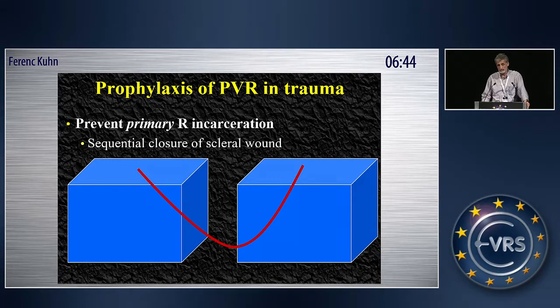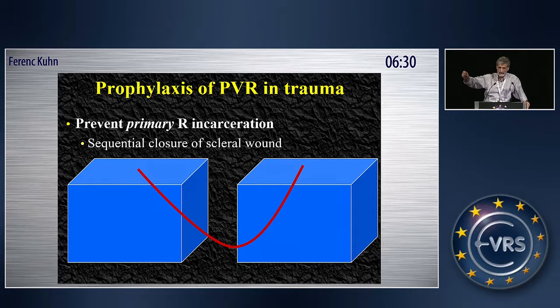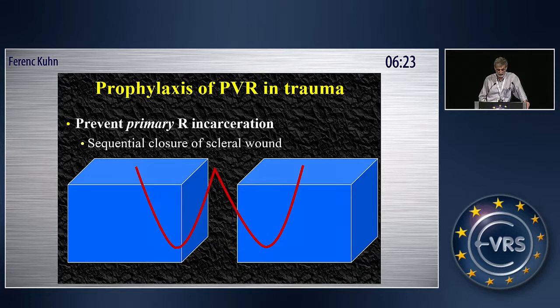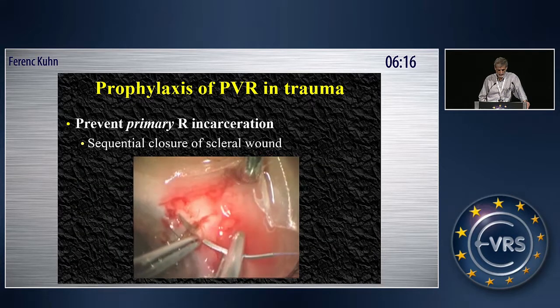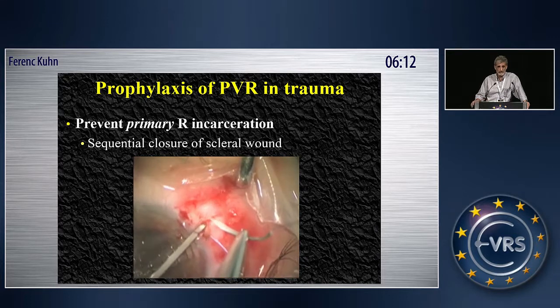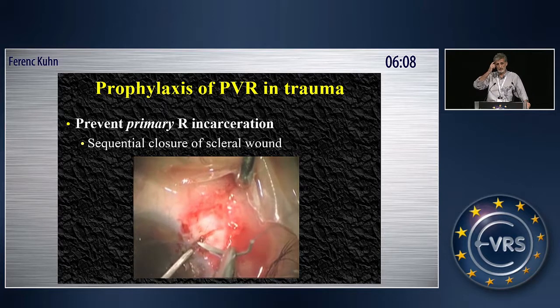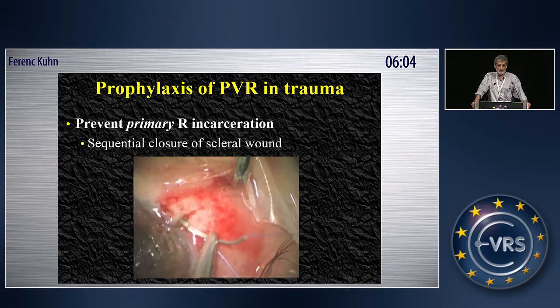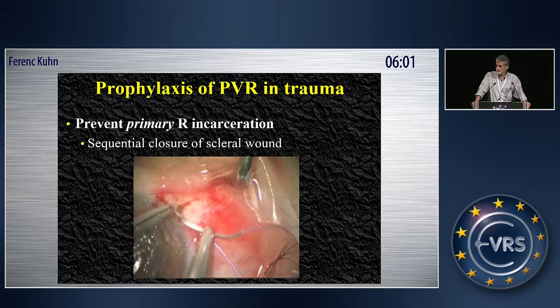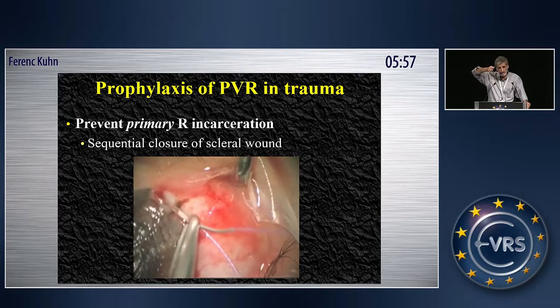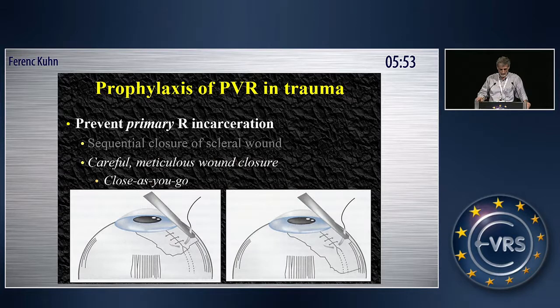Incarceration is a huge issue. This is something you can do to avoid trapping tissue, which will lead to a retinal detachment later. Traditionally when you close a wound you make one pass with the needle — this is a great way to catch retina in the posterior sclera. A very simple solution is to do a sequential suture introduction. You go in on one end, one side of the wound, you come out, and before you enter the other edge of the wound you are outside with your needle. So when you re-enter, you know that you are above the tissue and not inside.